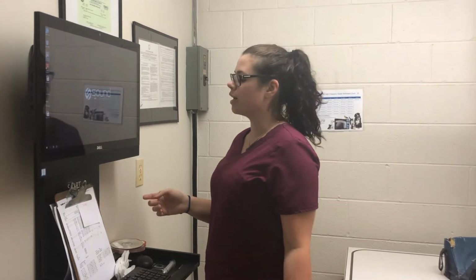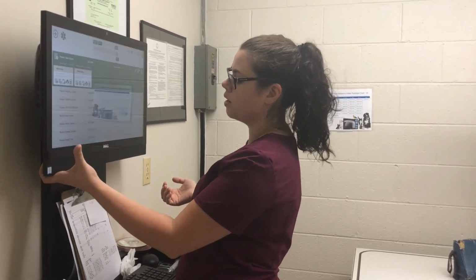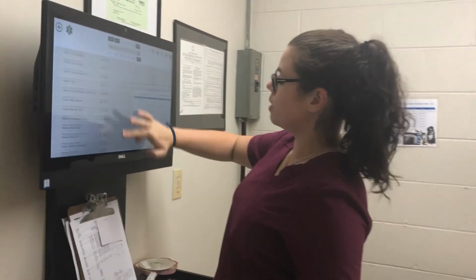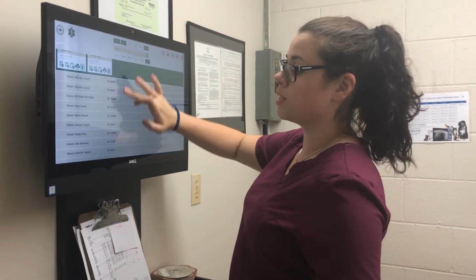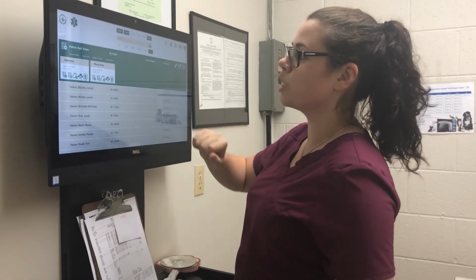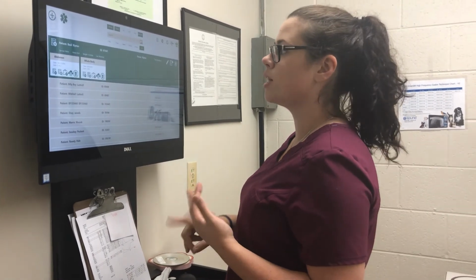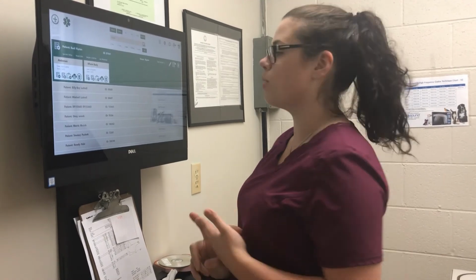Alright, today we are going to show you how to pull up past images that have been taken on our radiology system. So we want to go in here to our Smart VR icon, pull that up. Here we are displayed with pretty much an endless list of the x-rays that have been taken, so we don't have to sort through those. We can search here by a few different things. We can search by the patient's name, the owner's name, the patient's ID, the vet, the tech that was taking them, and the study that was done.